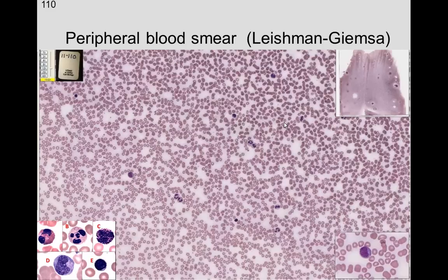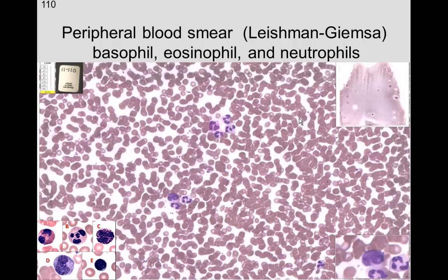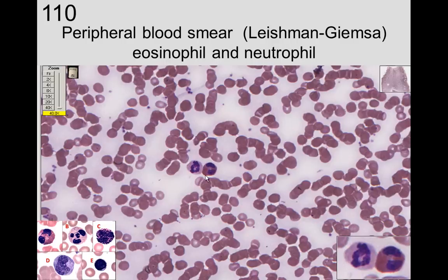Looking at slide 110, using the atlas as a reference, we have a monocyte, neutrophils, a lymphocyte, and possibly a large lymphocyte. In this slide we see three neutrophils, then another two neutrophils and a basophil.